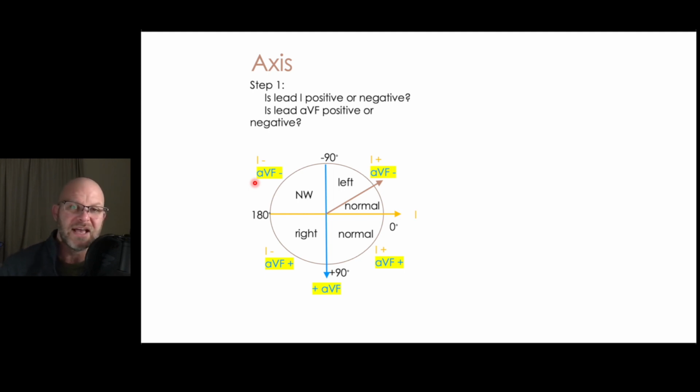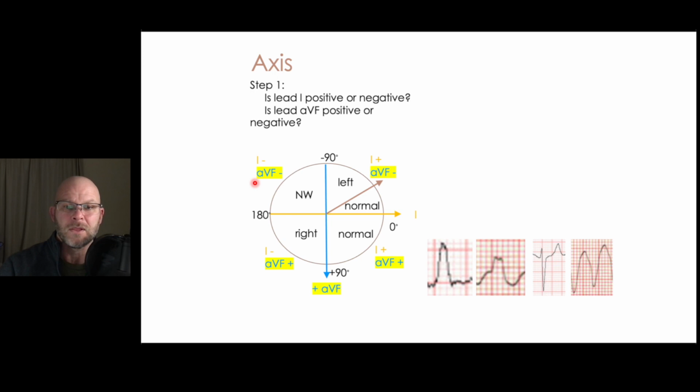If we look at AVF, AVF looks from the foot up. Now remember, your augmented vectors have two negative leads. So your augmented vector foot takes that red lead on the left leg, and it looks halfway between your black and your white lead. So it gives you a really good idea of north and south across that equator. When we talk about which direction the energy is flowing, we're talking about, from the isoelectric line, is there more energy north of that or south of that?